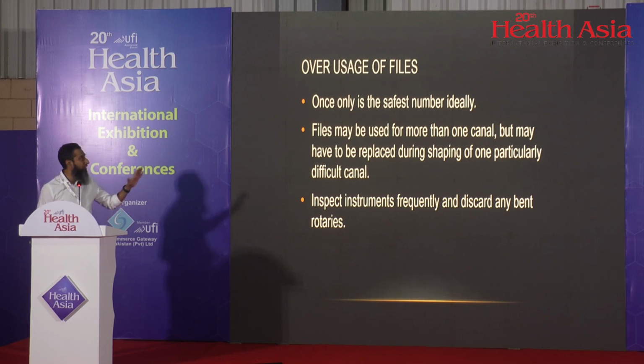Ideally, like I told you, only once is the safest number, but here in our system we might have to use it more than once, but you need to be careful or keep a track. Keep a track like how many cases you're doing. If you're doing a difficult case, mark it. Don't use it in another difficult molar. Use it in an easier case.